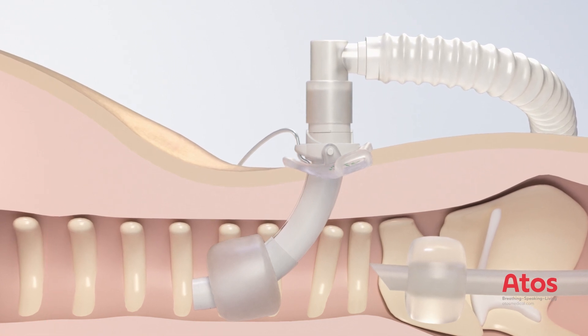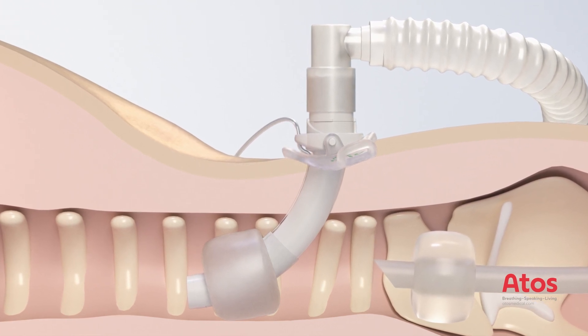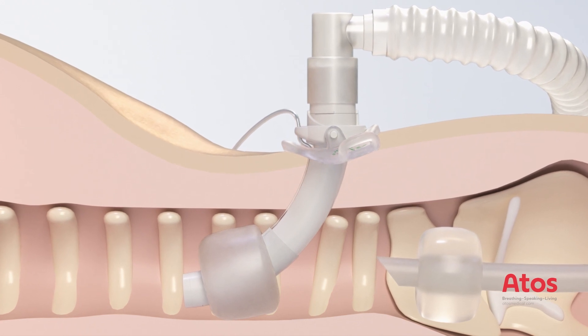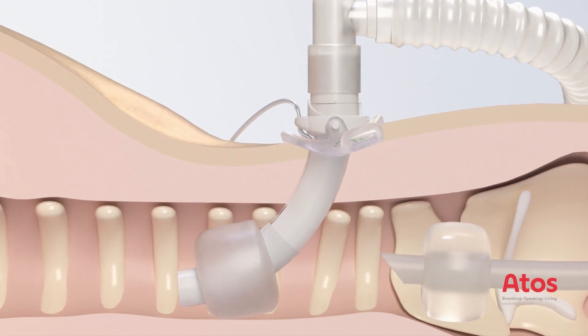The position of the tracheostomy tube is confirmed via the ventilatory circuit using a fiber optic camera. In addition, another fiber optic assessment is carried out via the ET tube. If necessary, correct the position of the tube during the checkups.